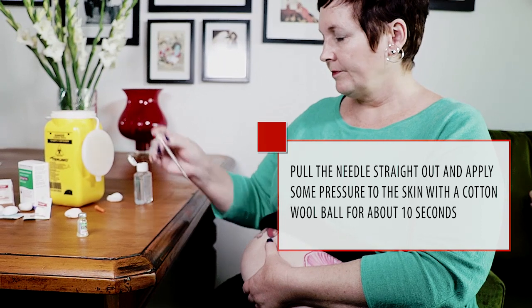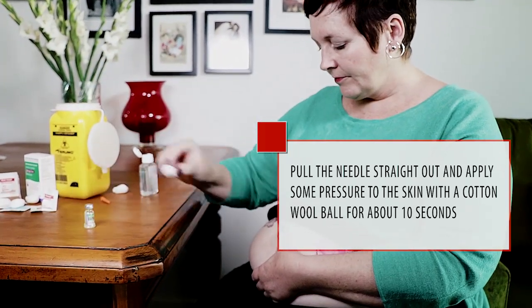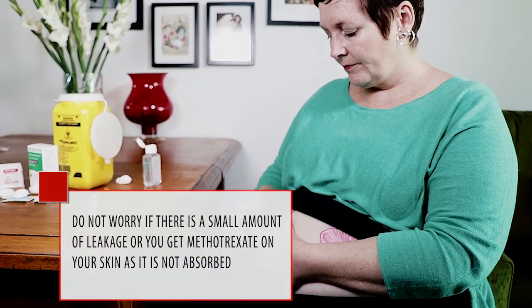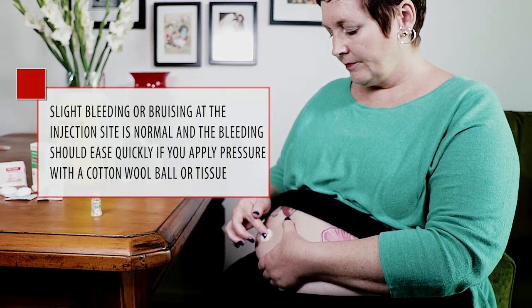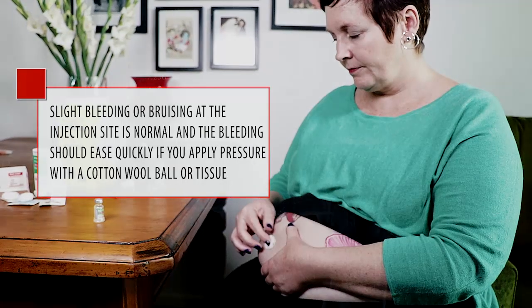Pull the needle straight out and apply pressure to the skin with a cotton wool ball for about 10 seconds. Do not worry if there is a small amount of leakage or you get methotrexate on your skin, as it is not absorbed. Slight bleeding or bruising at the injection site is normal, and the bleeding should ease quickly if you apply pressure with a cotton wool ball or tissue.